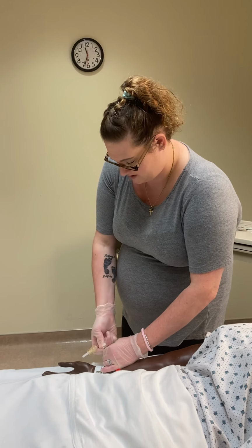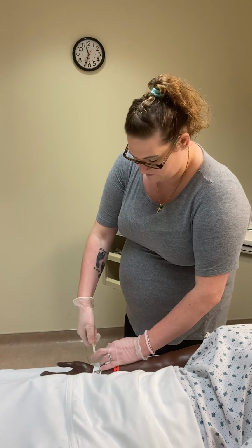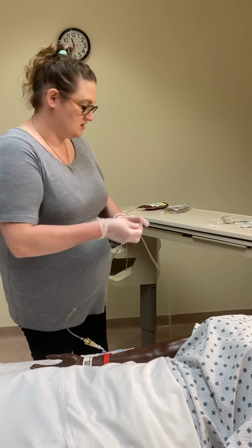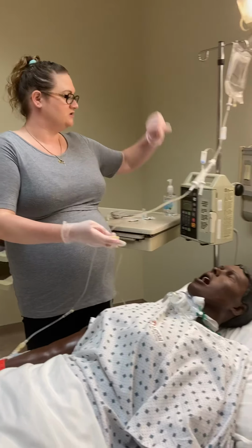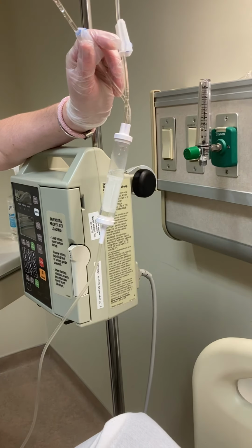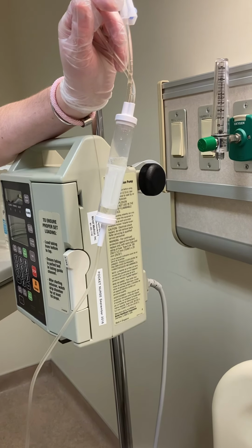And I said KVO before, which was keep vein open, which is 30 mLs per hour if we programmed it on the pump. And by gravity, it's like 5 drops per 1 minute. So super duper slow. Connect, and I'm unclamping it. And then I will set this by gravity. I would use my watch, and I'm gonna look here for my drops. And like I said, this is super duper slow. So it's literally gonna be like 5 drops in 1 minute.